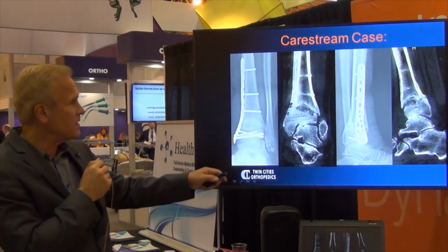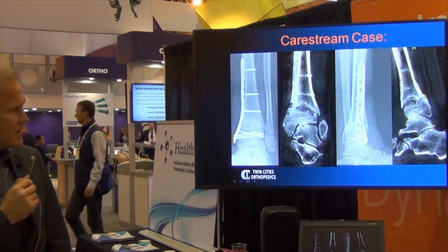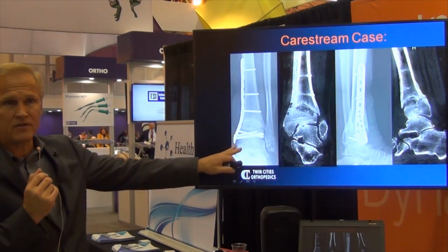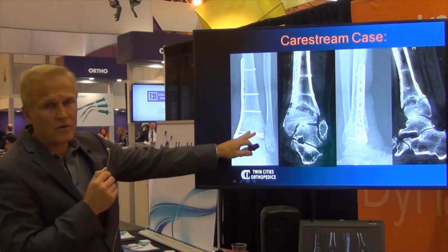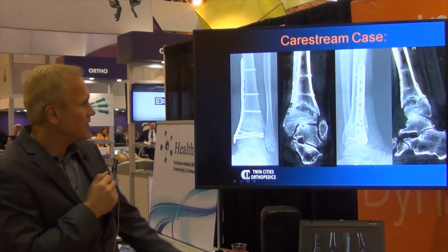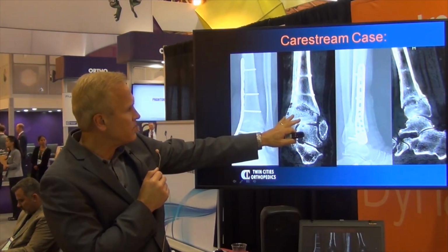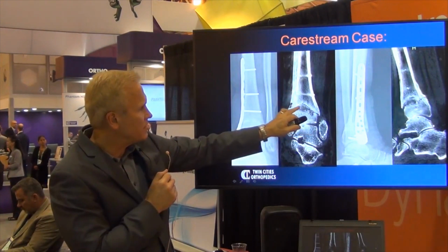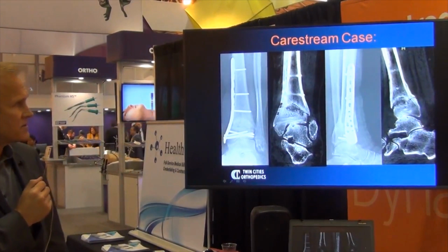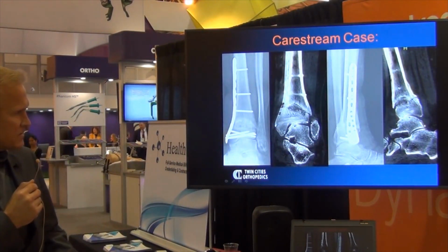So here's just another preoperative evaluation. A patient had a failed opening wedge supramalleolar osteotomy for a cavus deformity. You can see the x-rays don't really give you the information that you need to say for sure with any great confidence how much of that osteotomy is actually healed. And the CT scan with the MAR software in play gives me a very clear view that the majority of that osteotomy is not healed. You can see the sagittal view on the right side. It's clearly there's no connection or trabecularization across that osteotomy site.